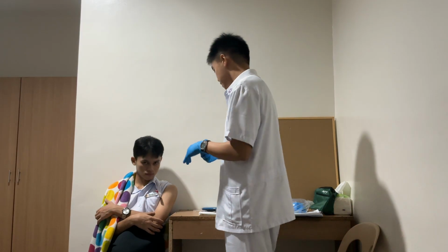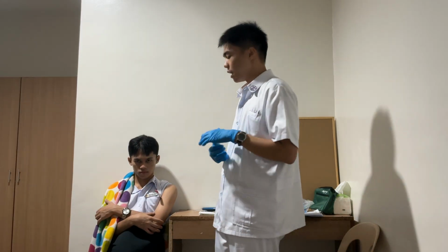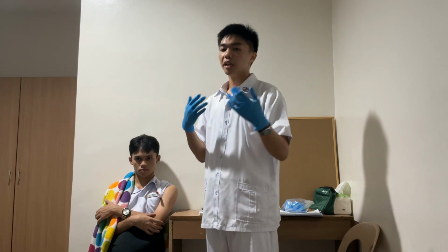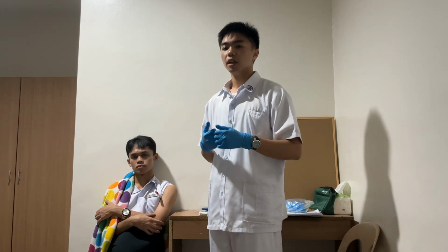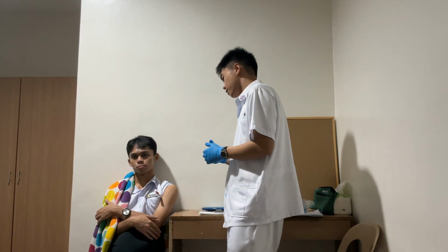Okay? So just wait for it. And after this, if you're already done, then we can proceed now to disinfecting again and then make it ready for the next use. Okay? So it will just make a sound now, or it will start blinking when it's already done.